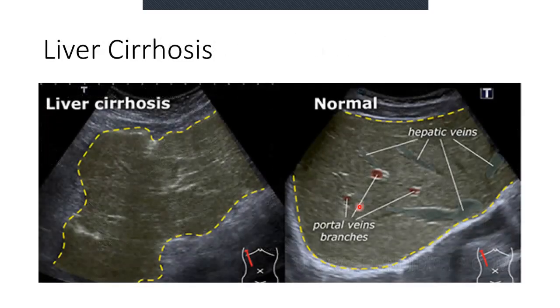So this is just one more thing to look at. So normal versus a cirrhotic liver. Normal liver, nice and puffed out, very easily identified granules. Whereas here on a cirrhotic liver, very often the shape is decreased. It very rarely is hepatomegaly with cirrhosis. Remember that, and you have very poor vasculature. All right. So just out of interest sake, I just wanted to show you guys that.